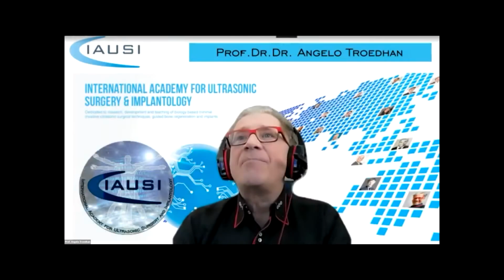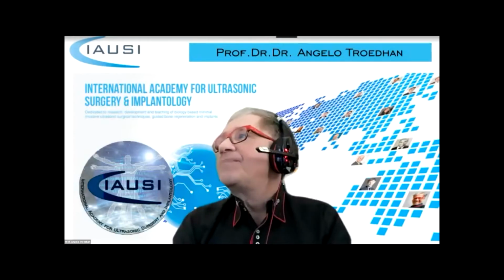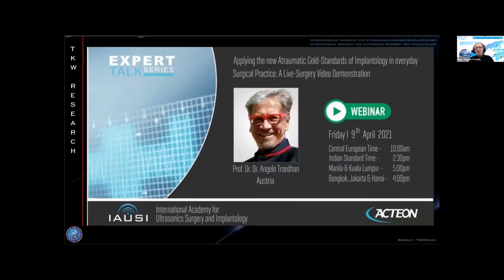And with today's topic, I chose that we are not going to do a lot of theory, because what mostly you will be interested in is how do I transfer the theoretical knowledge, all the science in the background we did in the last 15 years regarding ultrasonic surgery, how do I apply this knowledge and how do I apply these skills, which can be easily learned in a very, very quick manner.